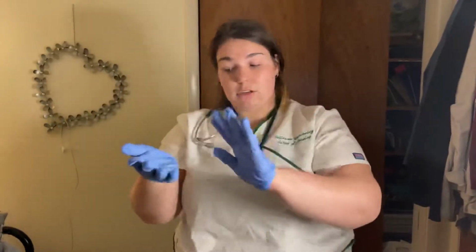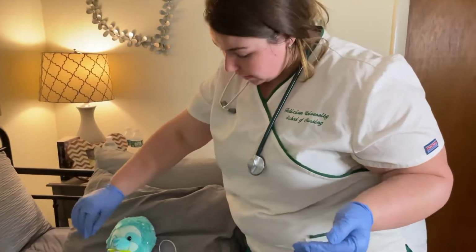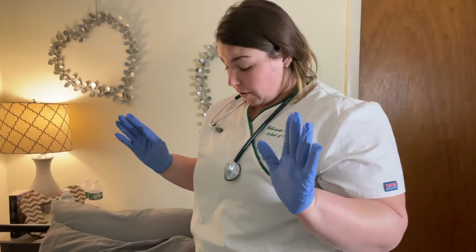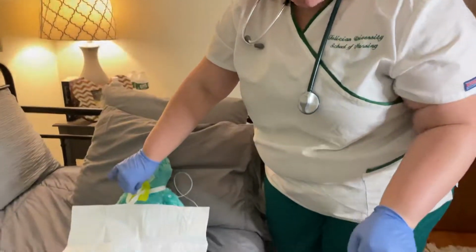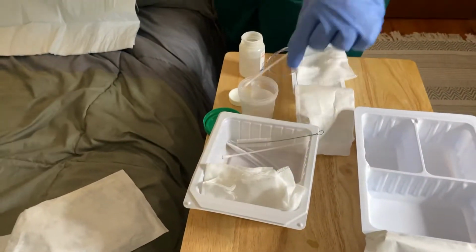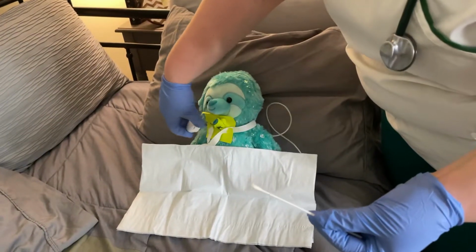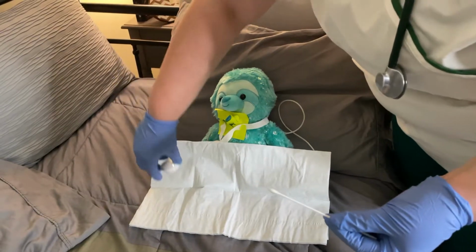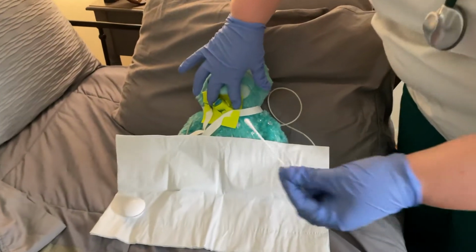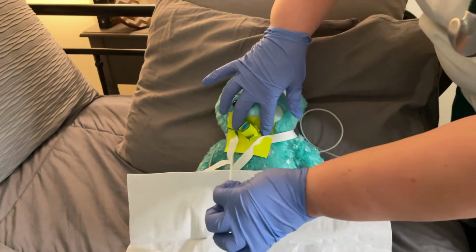So now what we're going to do is this again is going to become my clean hand. This is my sterile hand. I have my other sterile saline, different from the saline we used before. You're going to take your Q-tip, you're going to dunk it in the saline, you're going to secure the faceplate. Take the oxygen off, secure the faceplate, and you're going to use one Q-tip for cleaning underneath the faceplate.